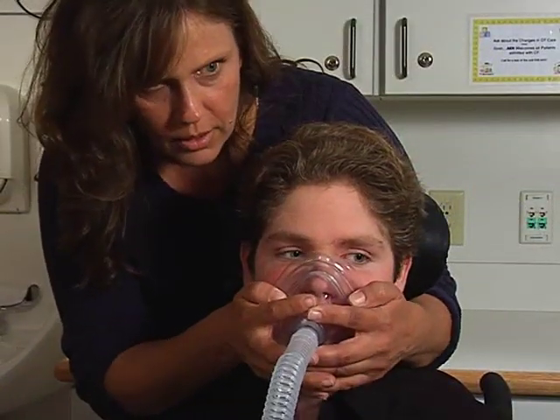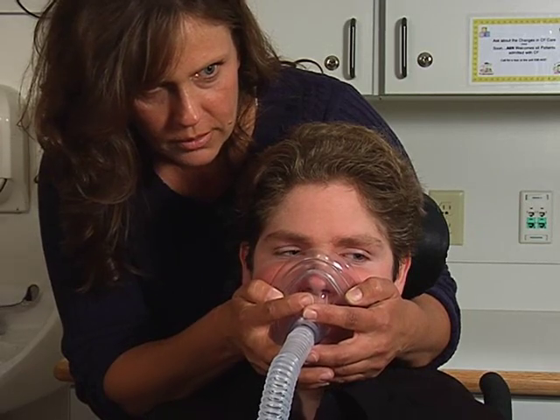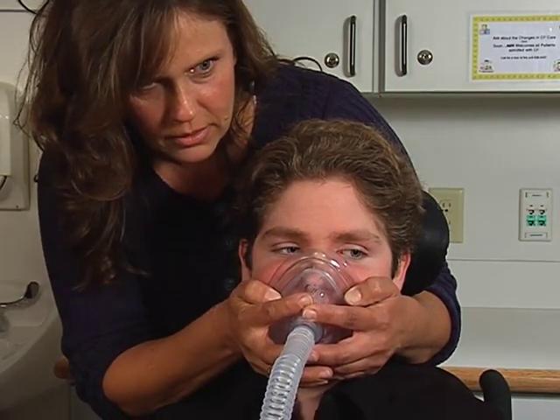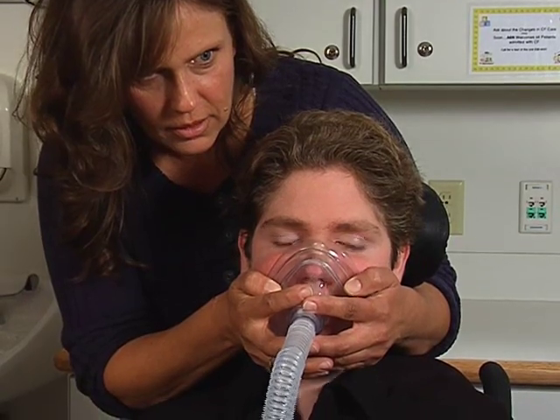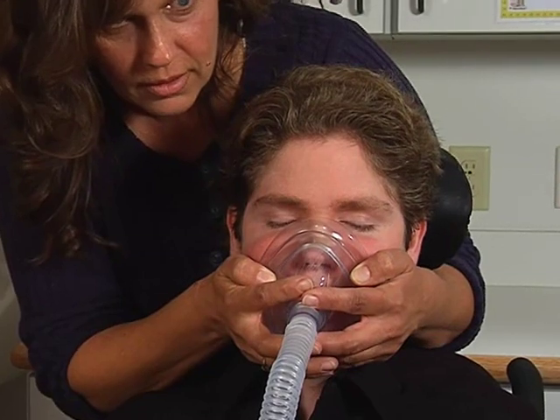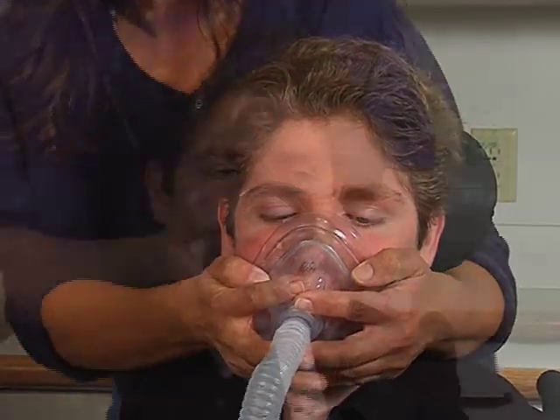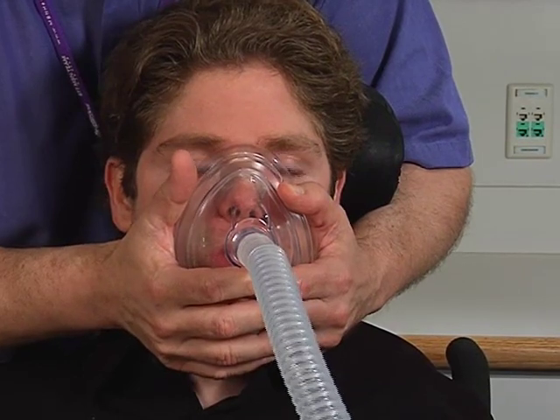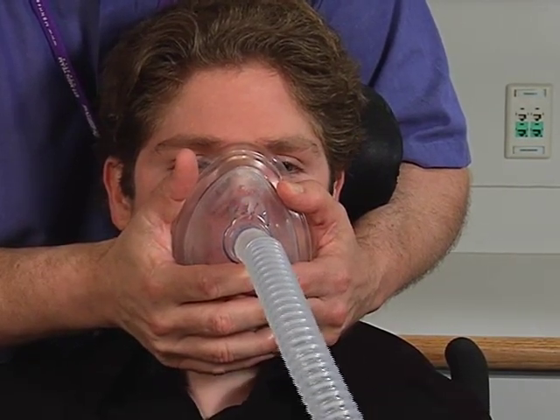Take a series of four to six assisted breaths continuously from the cough machine and then rest for 20 to 30 seconds. Remember to cough during the exhalation phase to cough out any secretions that may have loosened up. Repeat the series of breaths with a rest four to six times, or until you no longer have any secretions to cough out.